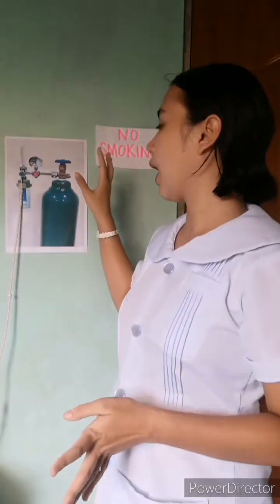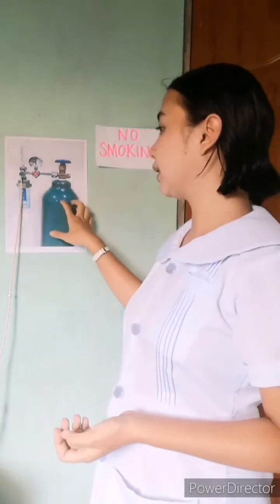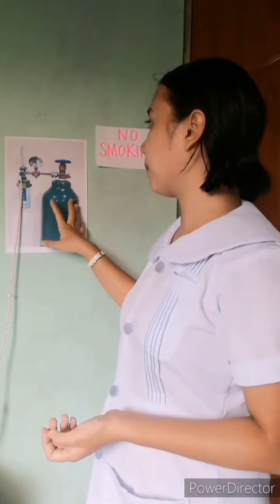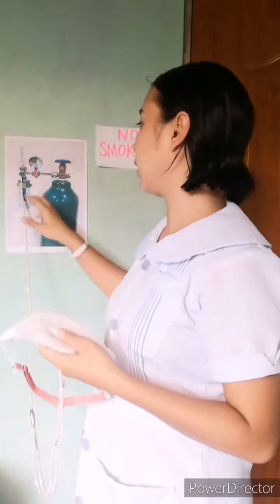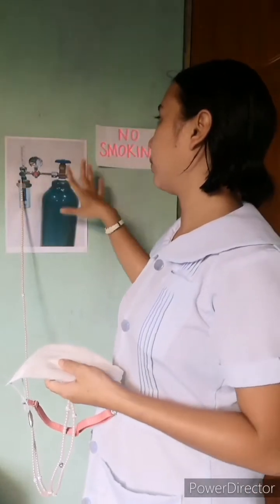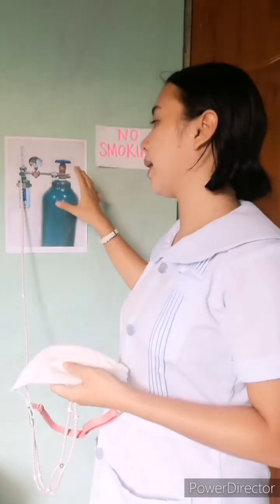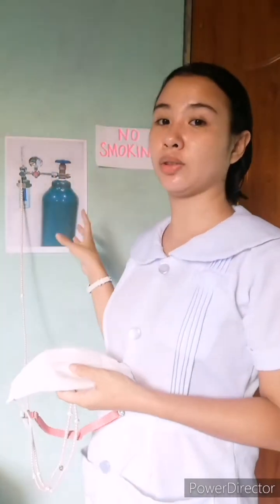Okay, so first we're going to turn on the oxygen tank. Then attach the oxygen mask. Here, I already attached the oxygen mask. Then I'm going to turn on the oxygen tank at the prescribed rate and ensure proper functioning.